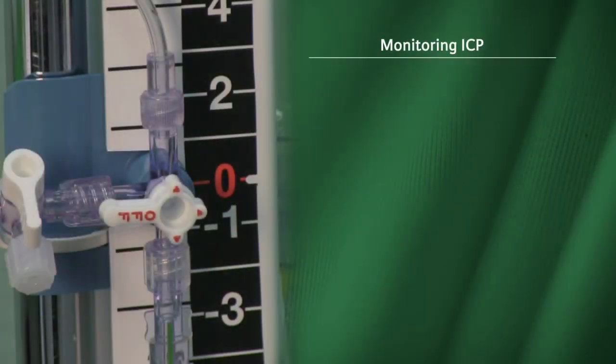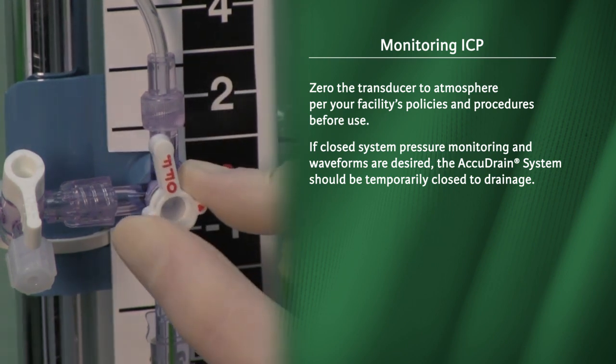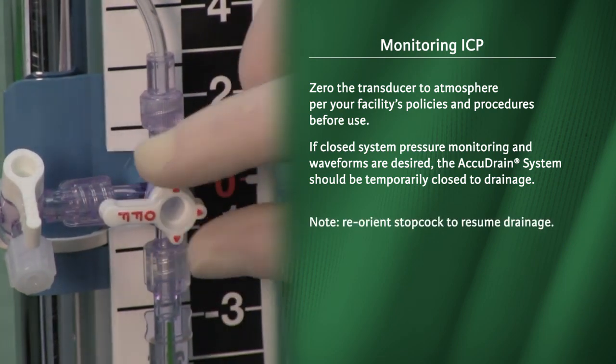Monitoring intracranial pressure. Zero the transducer to atmosphere per your facility's policies and procedures before use. If closed system pressure monitoring and waveforms are desired, the AccuDrain system should be temporarily closed to drainage. Note: reorient stopcock to resume drainage.